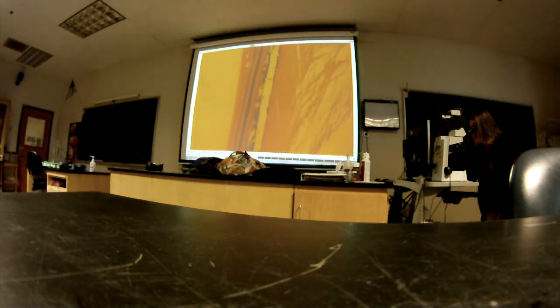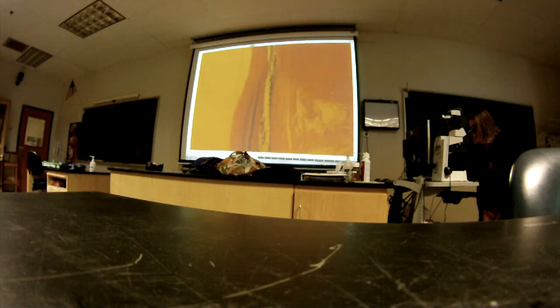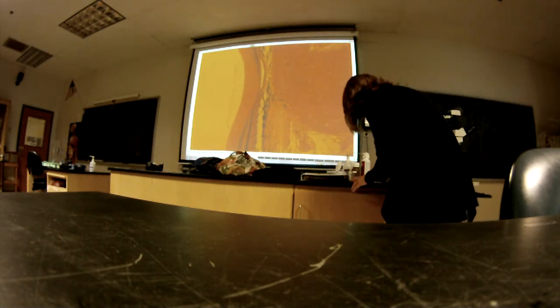Yeah. Is that the one that you wrote on the board the other day? Yeah, this is the one that we added that was actually superior, F20 to F22. This is F23, it is superior, although this one doesn't have as good an optic disc as the other one.